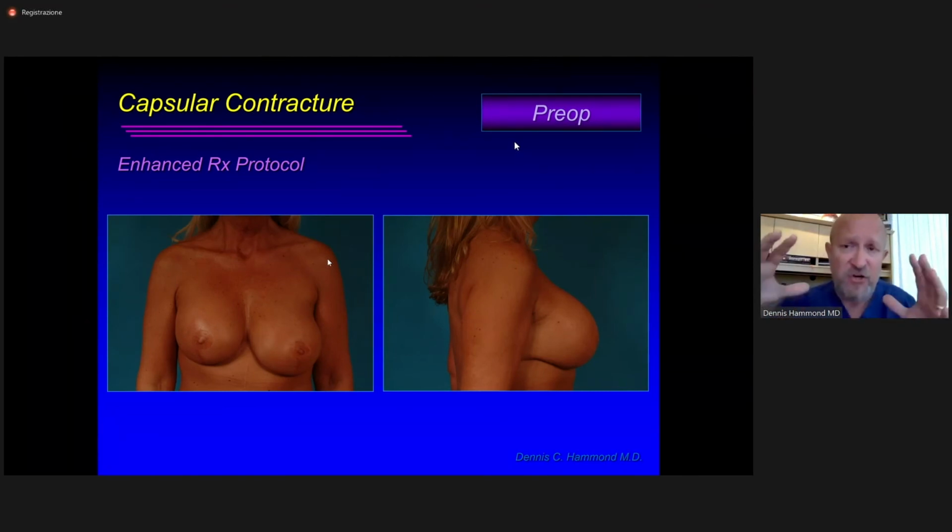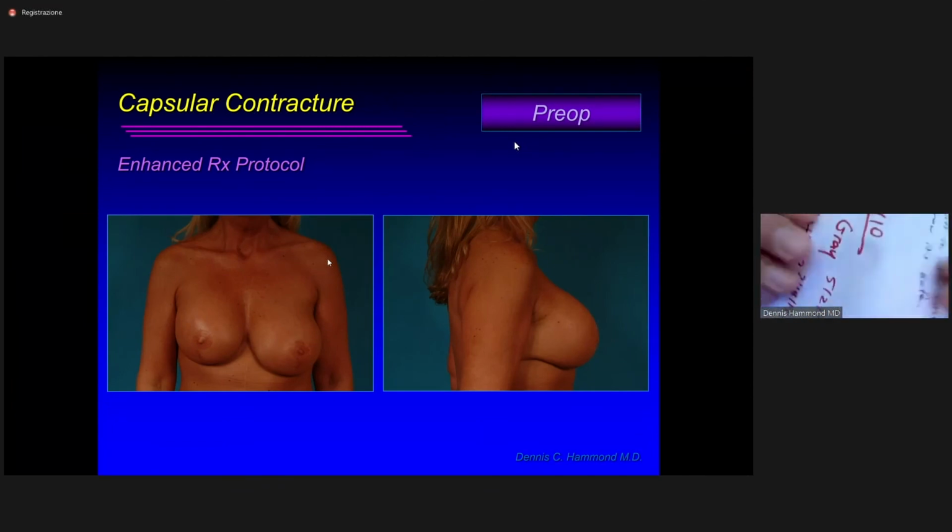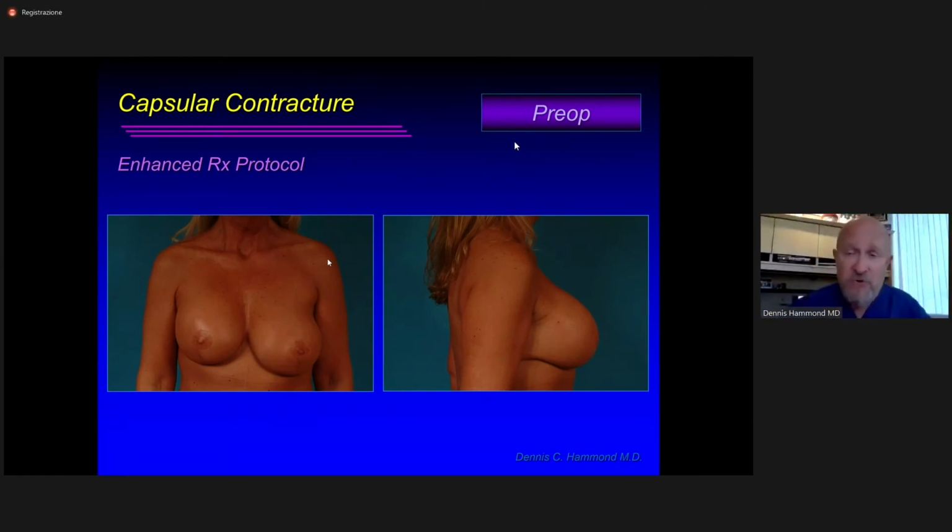When that capsular contracture wraps itself around the implant, what happens is the implant folds. I'll use this piece of paper. As that implant folds and as that wrinkle moves back and forth, you can see that weak spot that folds in the shell. As that wrinkle folds in the shell of the implant, over the years, that's a place of chronic stress. And as that stress accumulates over time, eventually that rubber will crack.